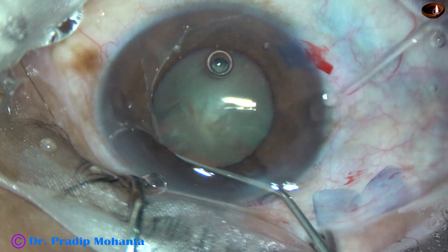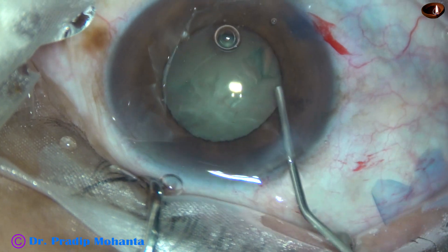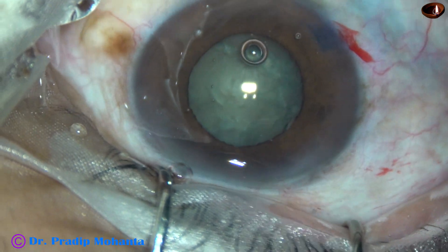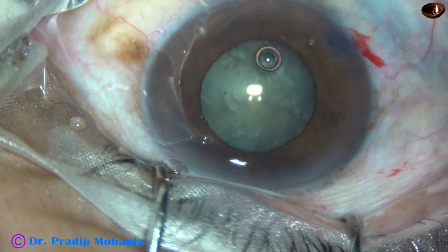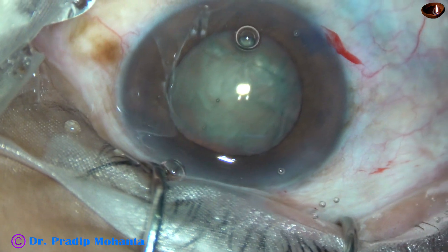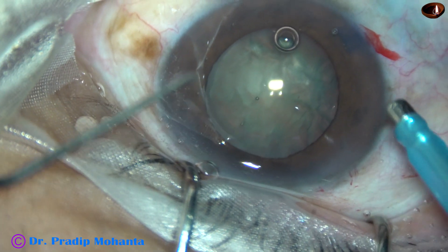Hydrodissection is done very carefully when the pupil has become so small. When the rhexis was being done, the size of the pupil was about 5 mm. And now, as I inject visco, it has dilated to about 5.5 mm.